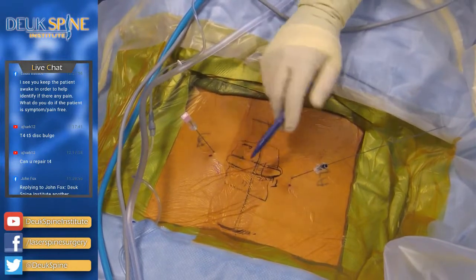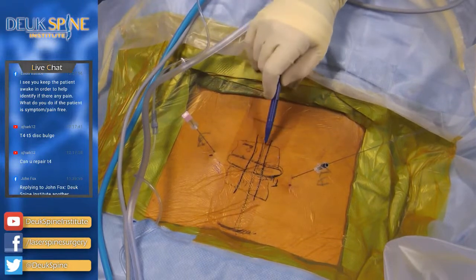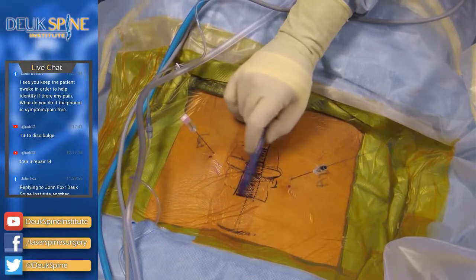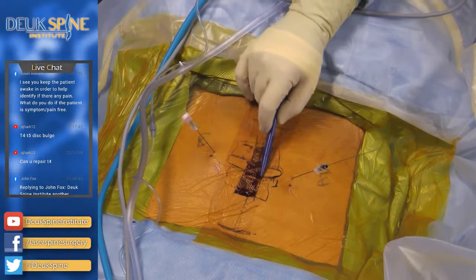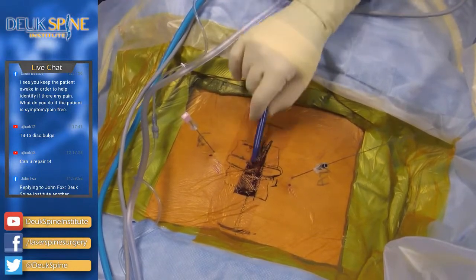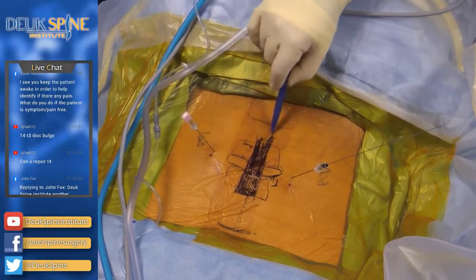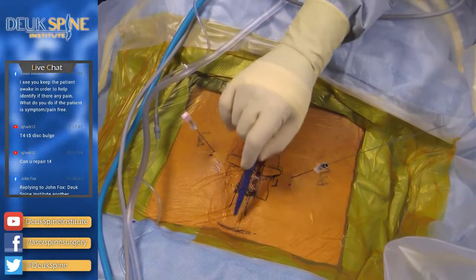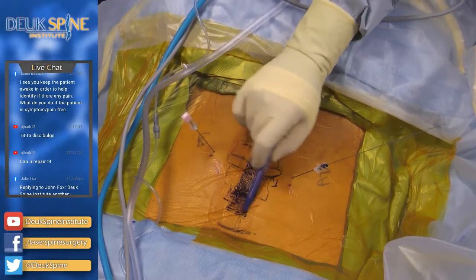And then the spinal cord sits right here. Okay, this is the spinal cord. You can't touch it as a surgeon. If you touch the spinal cord, you could cause a spinal fluid leak if you tear the membrane on the outside, or you could paralyze the patient from the waist down. All right, so you're not allowed to touch the spinal cord during surgery, anywhere near the spinal cord, all right? So that goes up to the brain, okay?